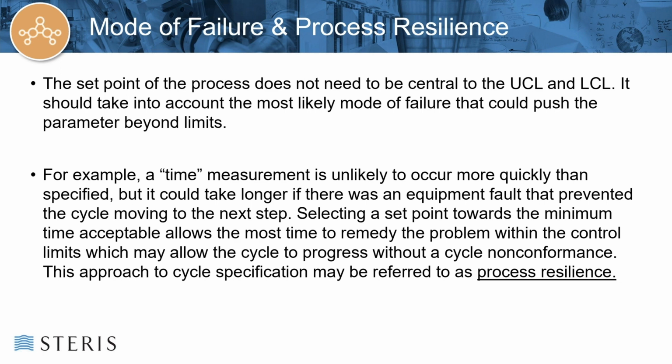So failure mode analysis is a very useful tool to proactively identify and address process deviations. The couple of examples that I've given are good ones to plug into a failure mode analysis. If we exceed this limit, what do we do to remedy it? If we don't meet the limit, what would we do to remedy it? And have your dichotomous chart to say, here's how we're going to do it, here's what we're going to do. Oh, by the way, here's the data that we need to generate in order to support all these. So your failure mode analysis will help to be your identifier and your plan.